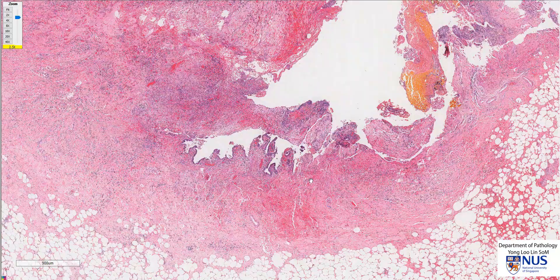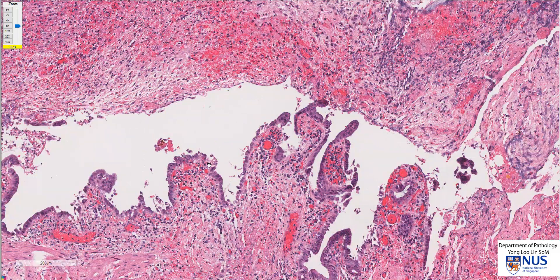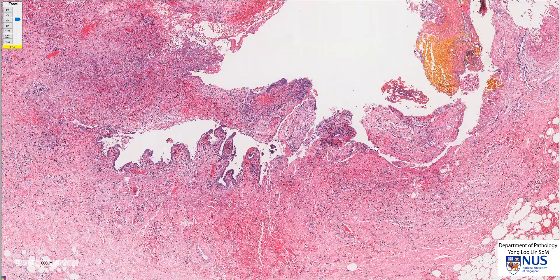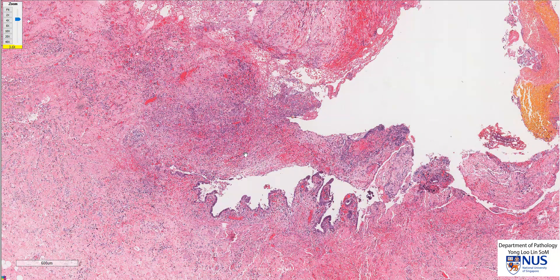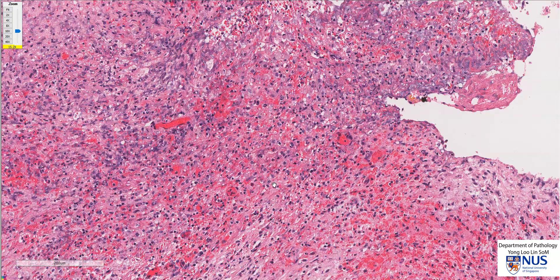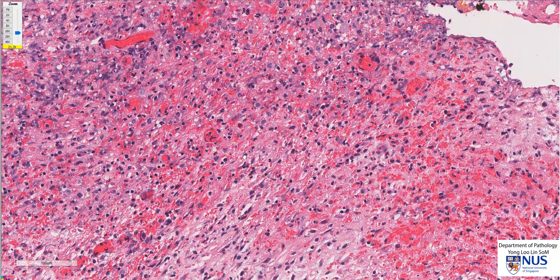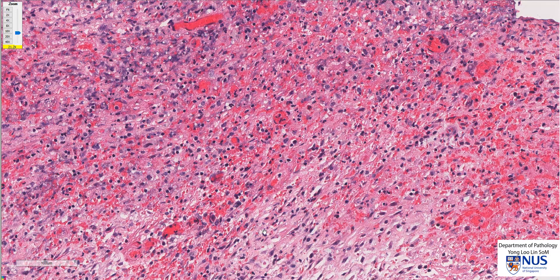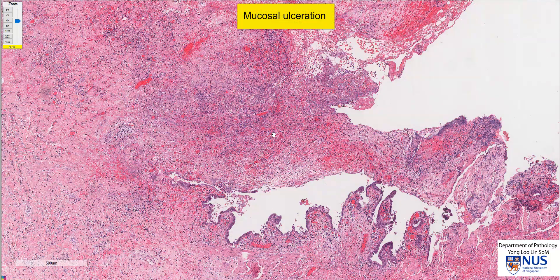Let's first look at the mucosa. While the mucosa is intact here, as we move along we can see that in some areas it is denuded or no longer seen. Especially in this area, we can see some acute ulcer exudates with a lot of fibrin, some hemorrhage with red blood cells that have escaped from blood vessels, and we also see some mixed inflammatory cells. So there is evidence of mucosal ulceration.